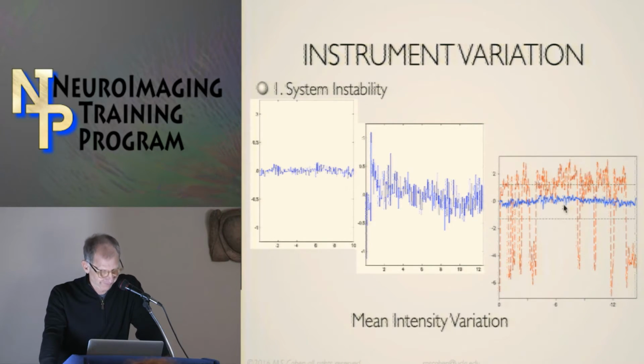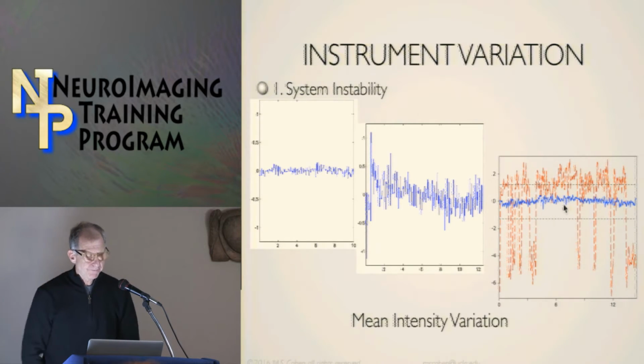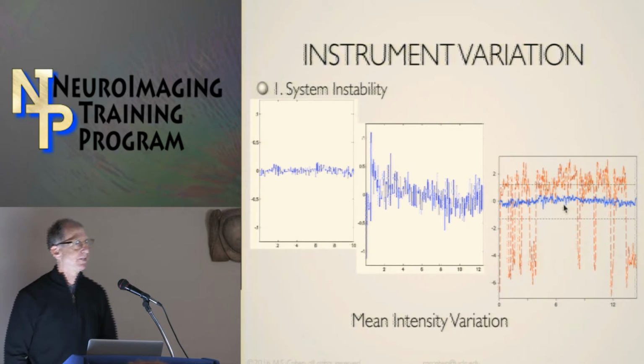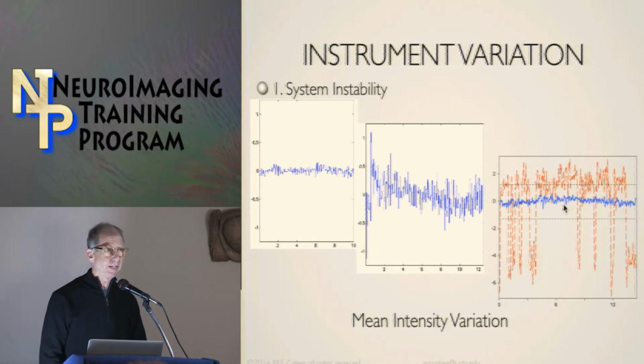You said on a good day versus on a bad day? Yes. So you mean that it can vary from day to day? And what are the factors that affect the MRI signal? Yeah, okay, good question. Yes, it can vary from day to day, not because August 17th is a bad day and August 15th is a good day necessarily, but because the parts on the scanner age.